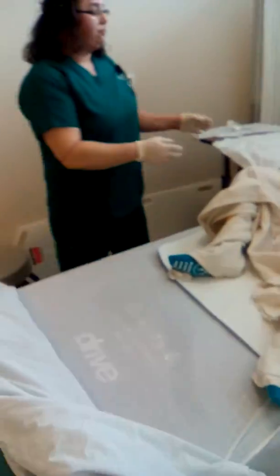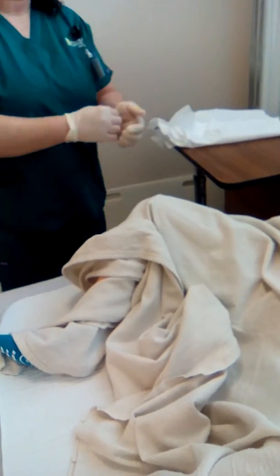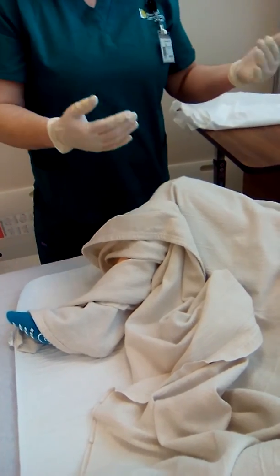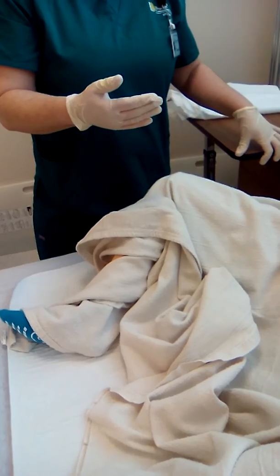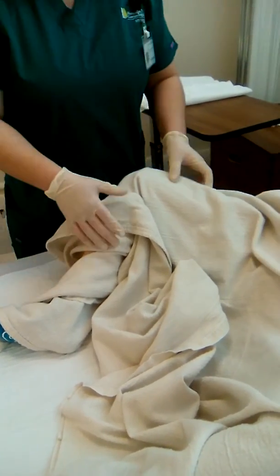I will re-perform hand hygiene. I will reapply my gloves. I will assist the patient to a comfortable position. I will place the call light within reach and all personal items.